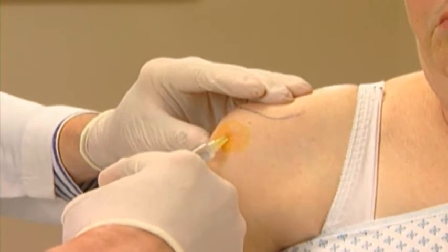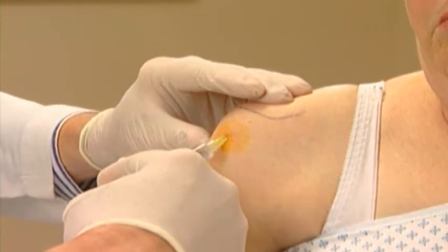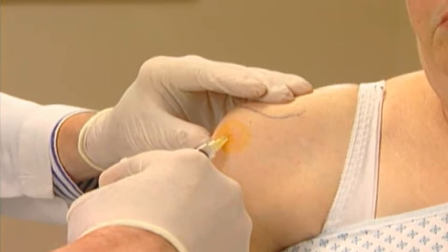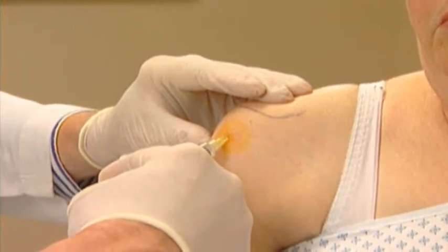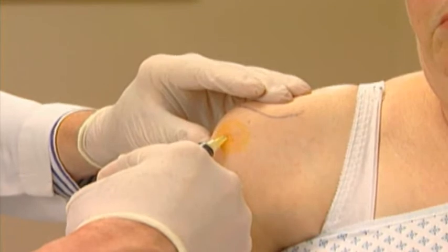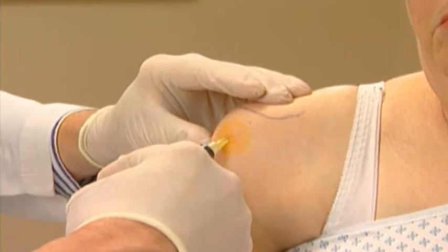If there is contact with bone, redirect the needle either slightly superior or slightly inferior in order to enter the space. In the correct location, the injection is made with minimal resistance.